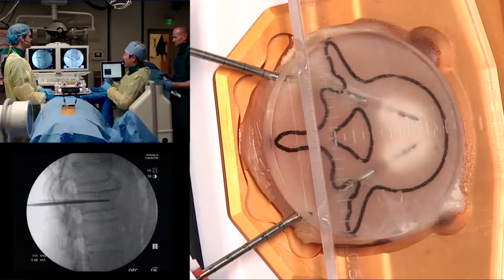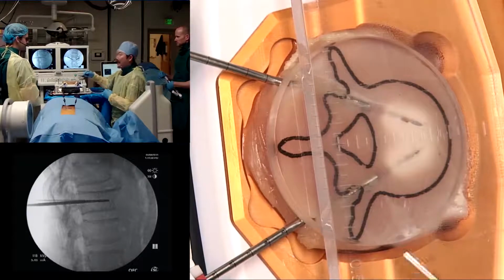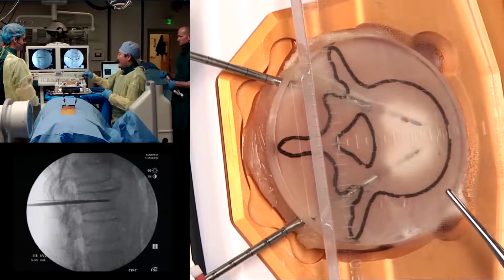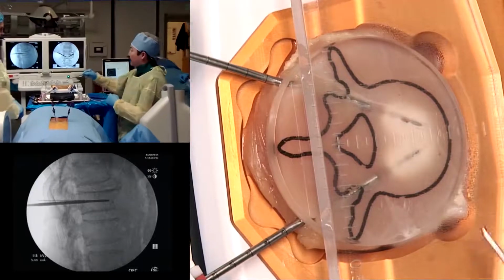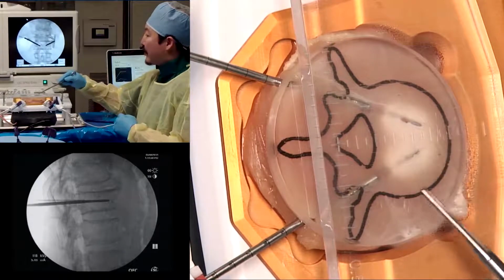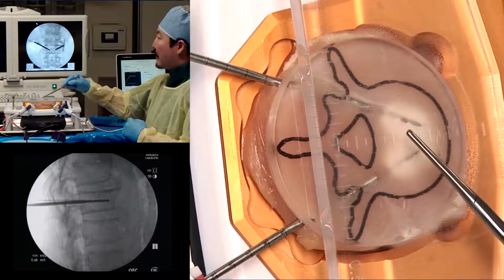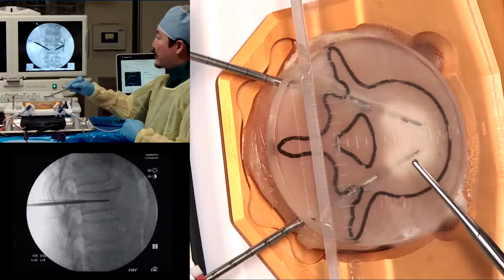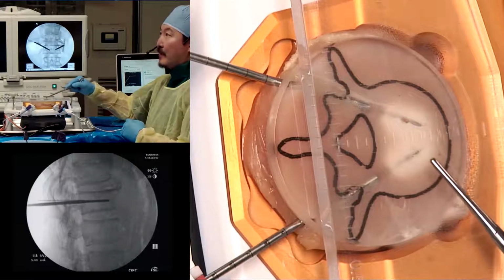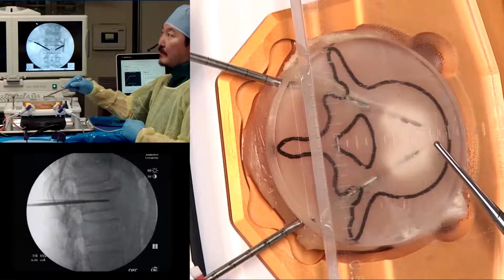But you can see this over time. We've had this cooking. This is actually a piece of chicken. Literally is a piece of chicken. So we've had this cooking now for the past 10 minutes or so. And so you can already see this area over here that has created this zone of heat from the RF probe. You can envision that if you actually had tumor cells here, that would help kill off some of those cells, right?